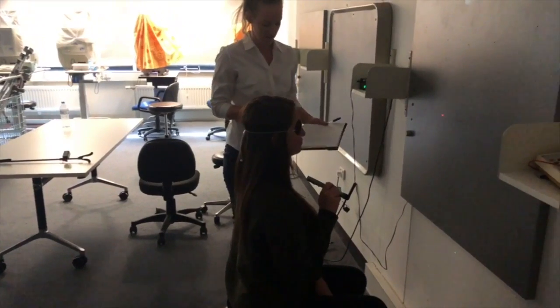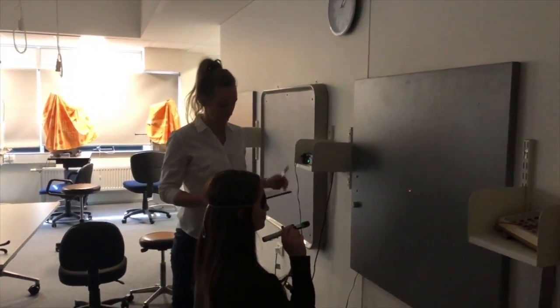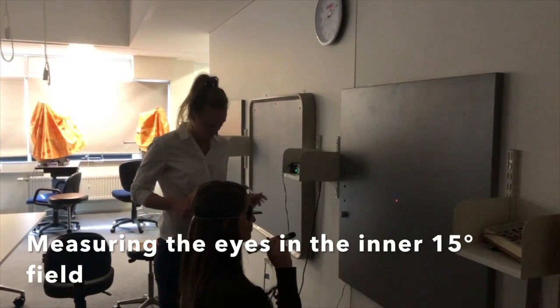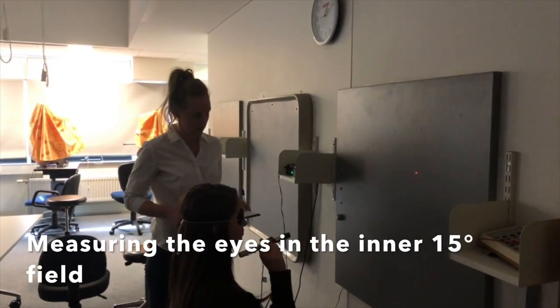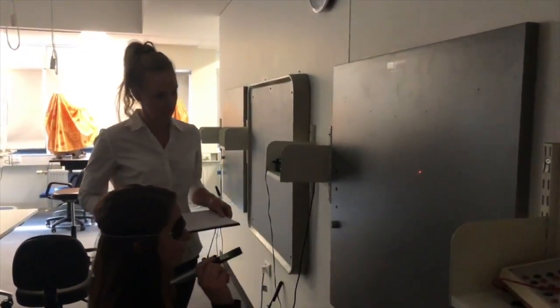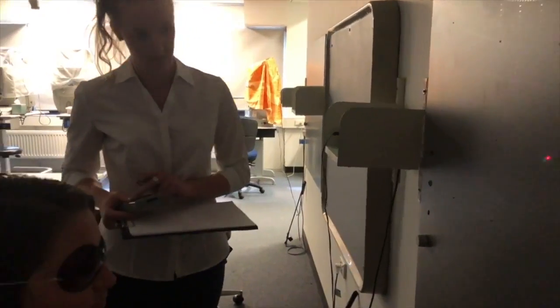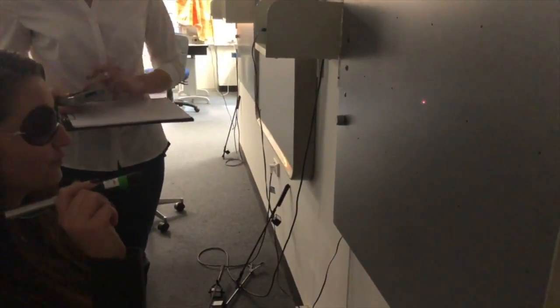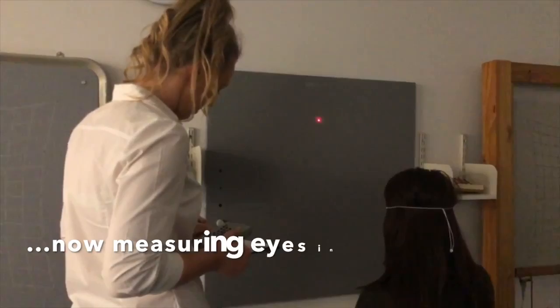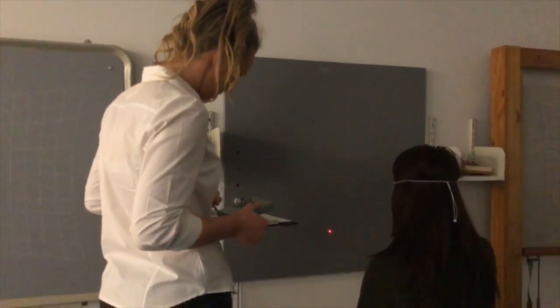Alrighty, so I'm going to move that red light and I just want you to put your green light right on top. Beautiful. And again. Looking down a bit for this one.